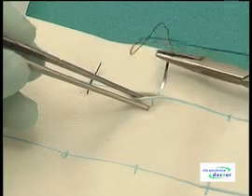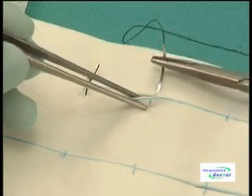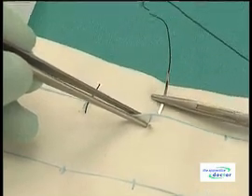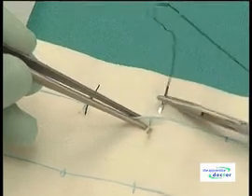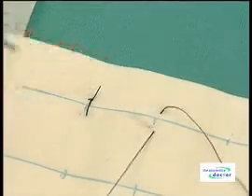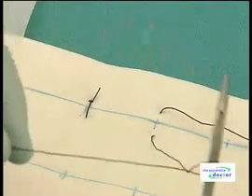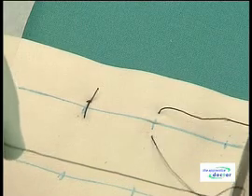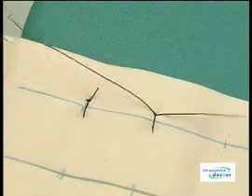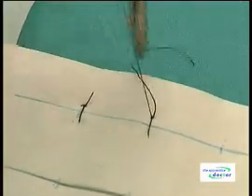Insert the needle in the depth of the tissue on the near side, exactly opposite the spot where the needle emerged from the far side. The course of the needle on the near side should mirror the course of the needle on the far side. Deliver the needle completely out of the tissue, including most of the suture thread, leaving a section of thread free on the surface of the skin. Tie an instrument square knot and cut the loose ends, leaving a long enough piece of suture material beyond the knots to facilitate easy removal of the sutures at a later stage.